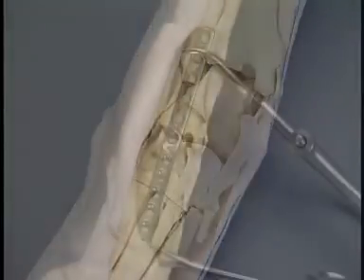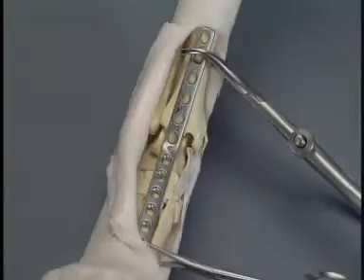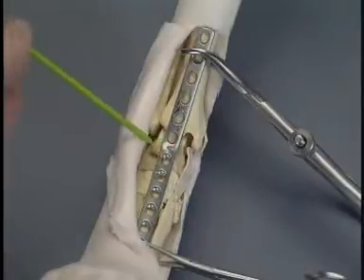A 12-hole 3.5 DCP is positioned. It's been pre-contoured to provide 140 degrees of joint angle to the cranial surface of the tibia, the talus, the central tarsal bone, and the third metatarsal bone. The acute bend in the plate is positioned over the neck of the talus.